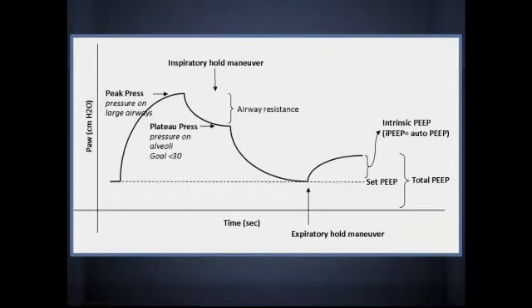On the pressure diagram, we can look at the I-PEEP, or the intrinsic PEEP. You do this during an expiratory hold maneuver, and you see what's the amount of auto-PEEP that's over your set PEEP. So usually a set PEEP of 5, for example. You're looking at this intrinsic PEEP over that, and that would be an indicator that you're having some auto-PEEPing.